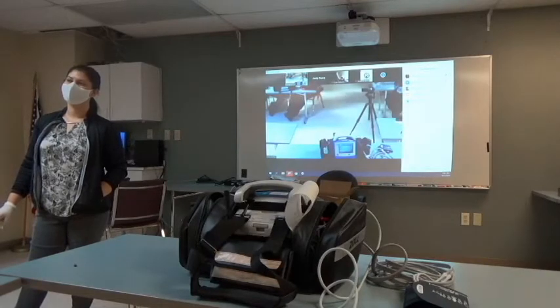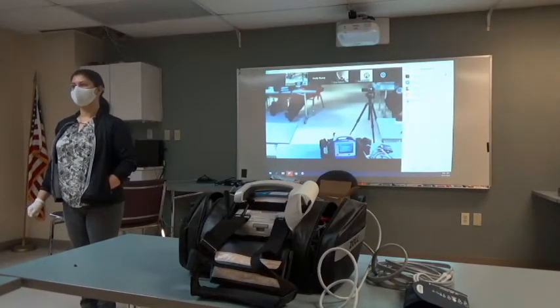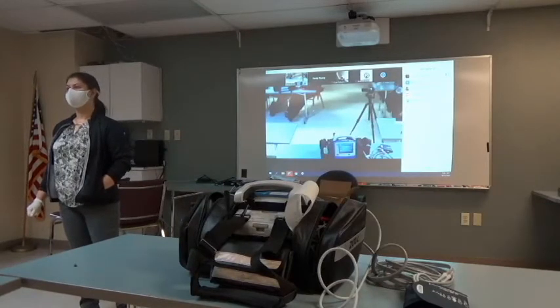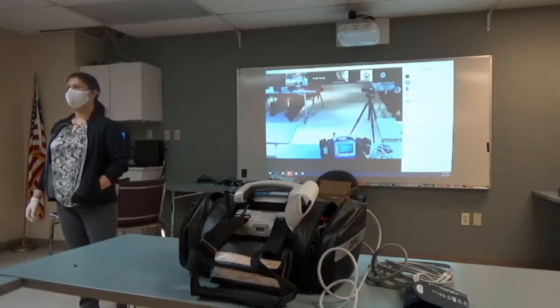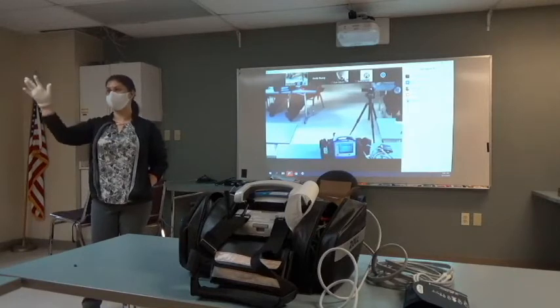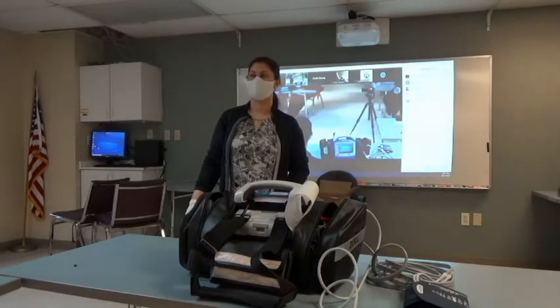How does the monitor know which patient it is? So I understand your question now. When you hit EKG import, you'll see a catalog of all the patients that are currently pending import, and you'll select that based on time. Okay. That makes it even more important to put a name here. Yeah, and I haven't seen it from Zoll, but I know on the Physio side, whatever data you put in to identify the patient, the PRID, or in the case of the monitor, a medical record number, the date, the time, and if the name is in there, the name, then you can pick that. The name would be important for the Zoll leads. For most patients, it's going to be time-driven. And we can even identify each device by unit number or whatever. We can further identify it. Did you say the snapshots do that too? Yes.